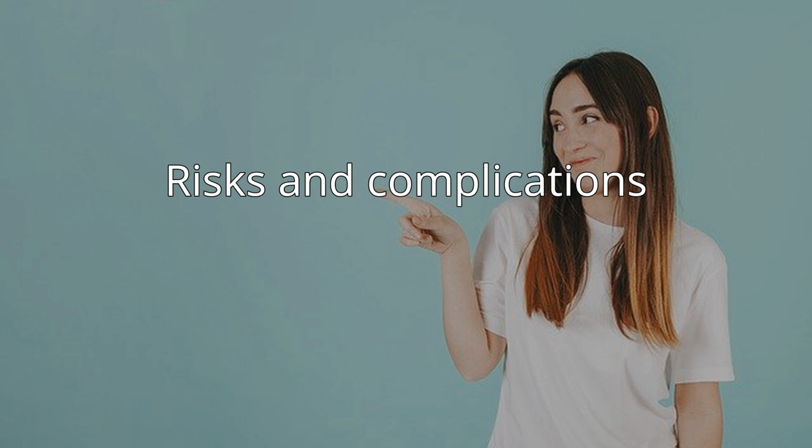CPB may contribute to immediate cognitive decline. The heart-lung blood circulation system and the connection surgery itself release a variety of debris into the bloodstream, including bits of blood cells, tubing, and plaque. For example, when surgeons clamp and connect the aorta to tubing, resulting emboli may block blood flow and cause many strokes. Other heart surgery factors related to mental damage may be events of hypoxia, high or low body temperature, abnormal blood pressure, irregular heart rhythms, and fever after surgery.